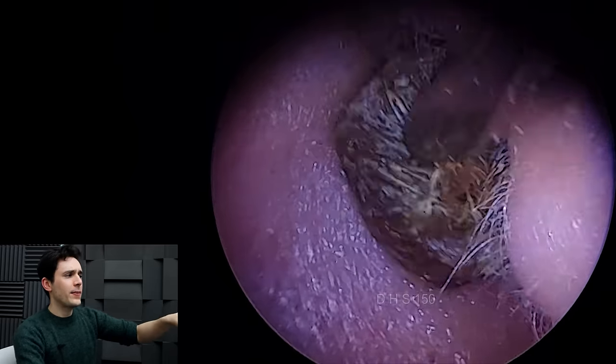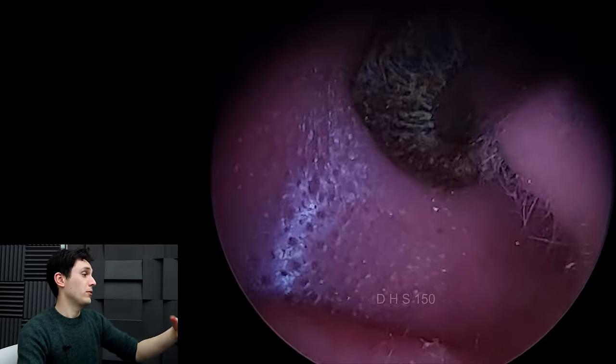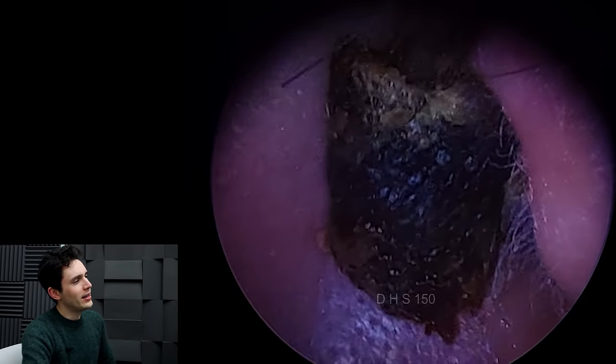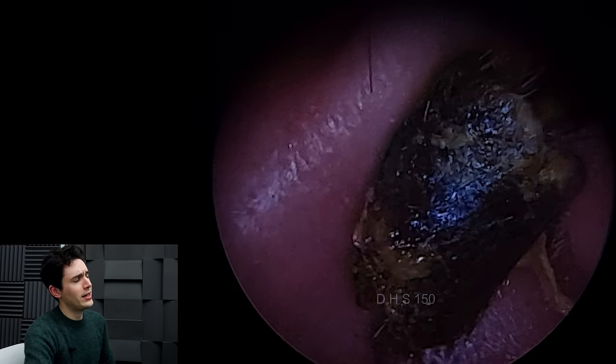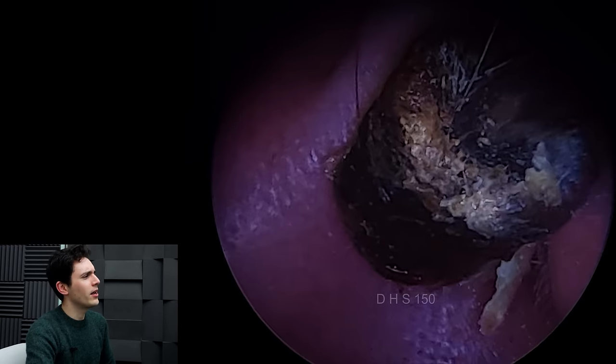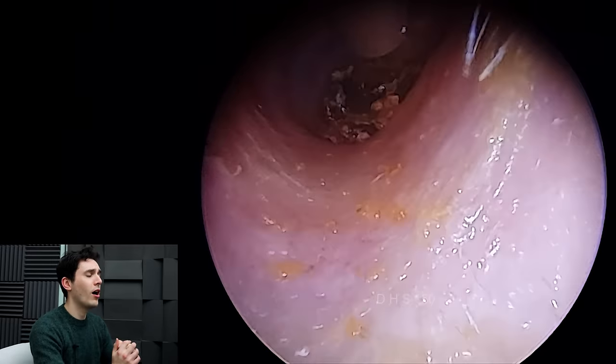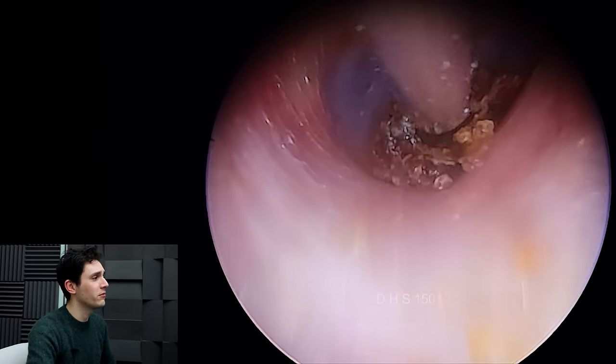But I wasn't expecting this. Judge for yourself when it comes out. It is like a cylinder — a perfectly shaped cylinder of just, you know, hard as nails stuff in there.